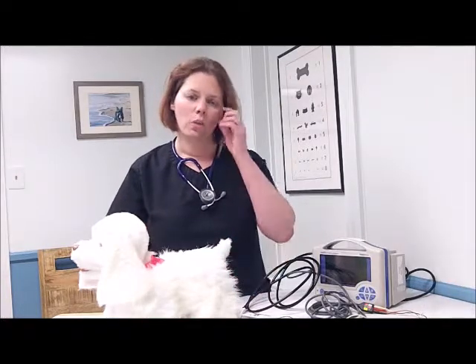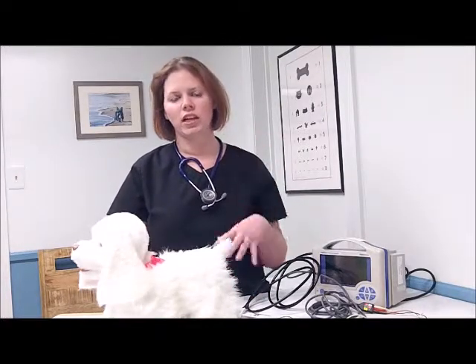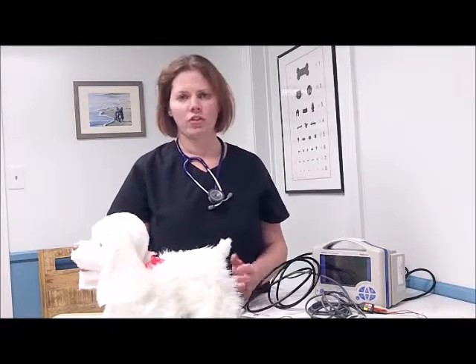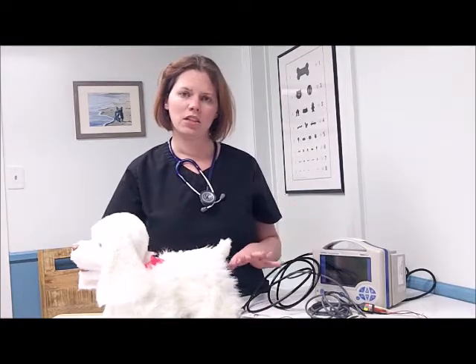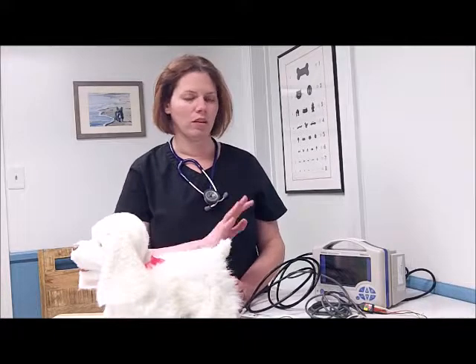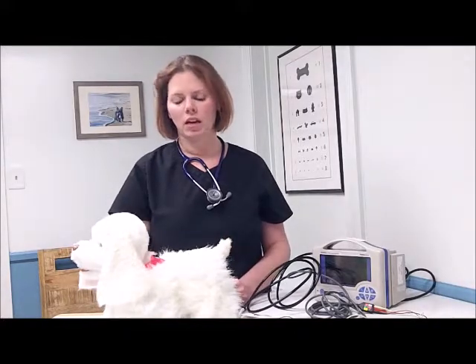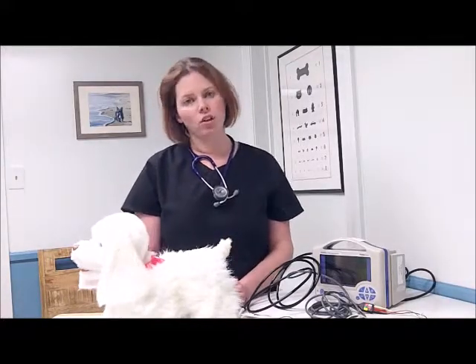Some animals, particularly dogs, can have a sinus arrhythmia, where the rhythm changes during inhalation and exhalation. Anything other than that should definitely be brought to the doctor's attention. Things like an AV block, a first-degree AV block, may not be heard on just the normal beeping sounds that the ECG machine makes. So that's why it's important to have a visual aid of the rhythm to help with that as well. Respiratory rate and rhythm is also important.